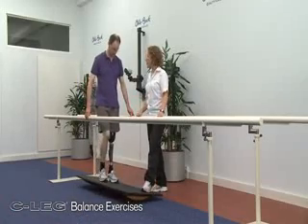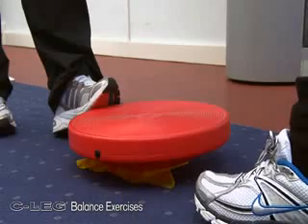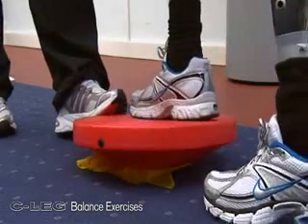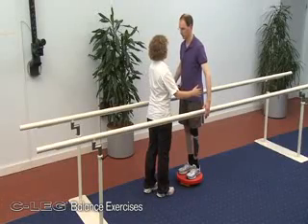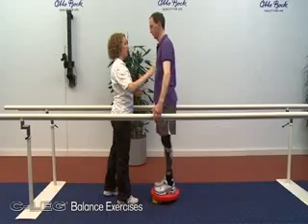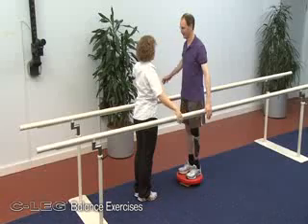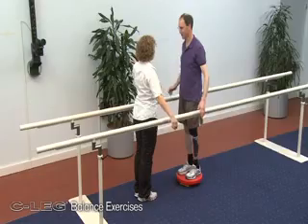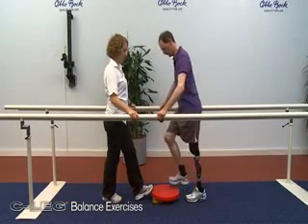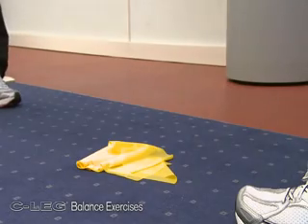The therapist should use his or her foot to control and manage the movement of the rocker board during this exercise. Once the exercises on the rocker board can be completed without problems, a wobble board offers possibilities for additional levels of difficulty. It moves freely in all planes. Once again, various challenges can be posed for the amputee. For safety reasons, the wobble board should only be used on a slip-resistant surface.